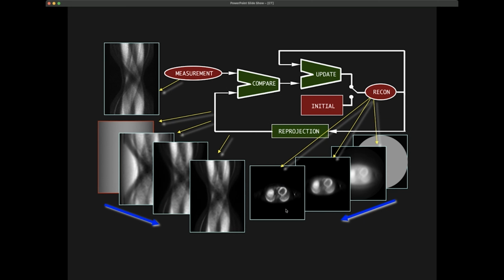But this also has a very important advantage, because now you're not going to mathematically relate these two images, but you're just going to find what's the most likely. And the advantage is that if you mathematically say, this is my measurement, and let's find the theoretical distribution that you have, then if you have noise in your measurements, obviously you would reconstruct the noise.